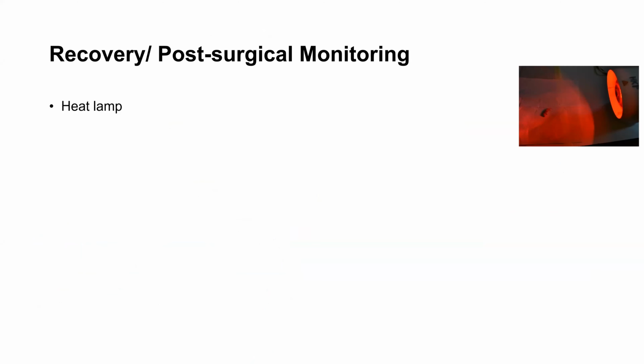For recovery, place the pups in front of a heating lamp, and you will recognize the recovery by spontaneous breathing and circulation. And this should not take more than 2 to 3 minutes. And when the pups have recovered, then you need to put them further away from the heating lamp to prevent burning the skin, but keep them warm, either further away from the lamp or on a heating plate.